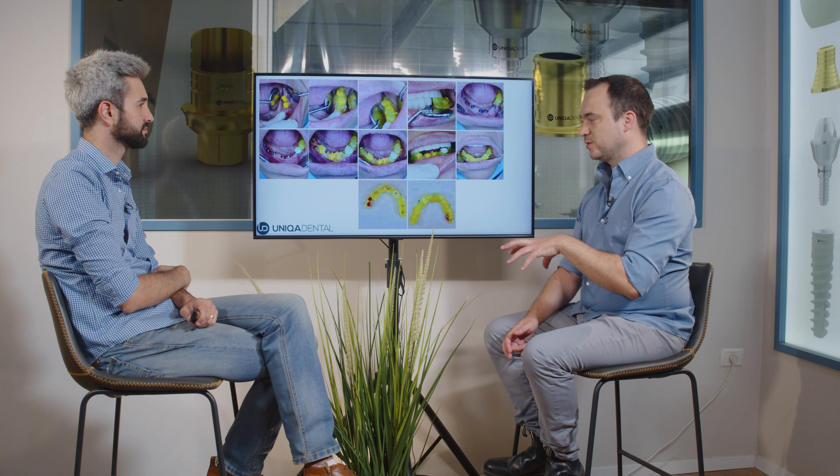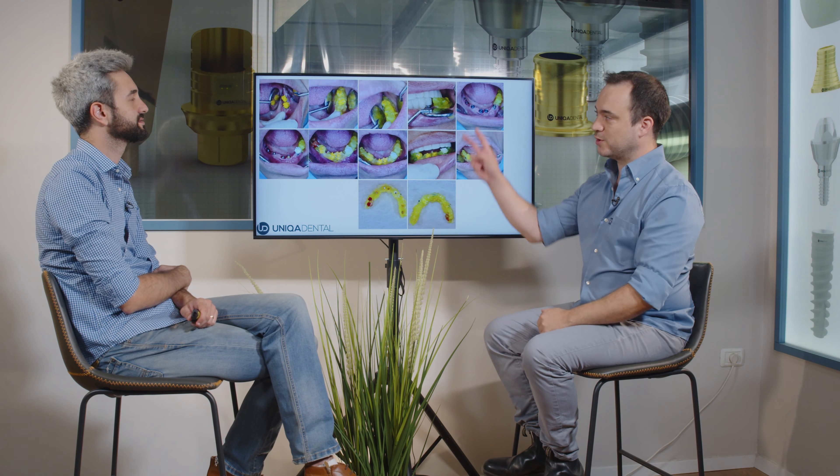So what we did is we took the impression step by step. At first we added transfers — you can see the upper left picture — in the place where we added a couple of implants. On the transfers we attached caps, and on those caps we poured composite material and brought it to occlusion. So in this case we fixed the occlusion of the patient. From now on we can take out the rest of the bridge, add transfers and caps, and all the other transfers and caps connect together and take occlusion from those original two positions we fixed.